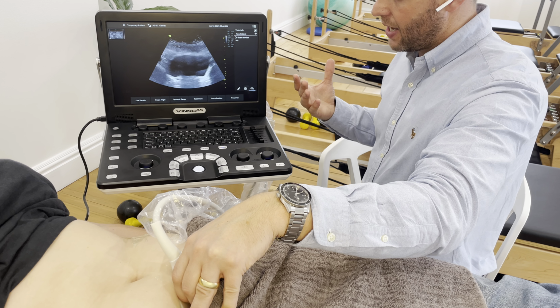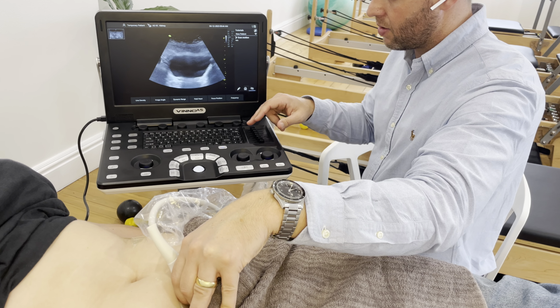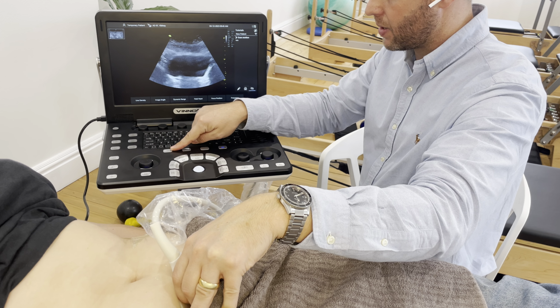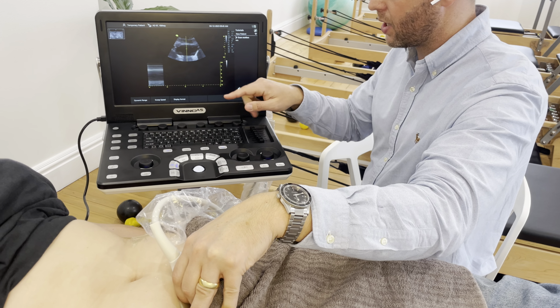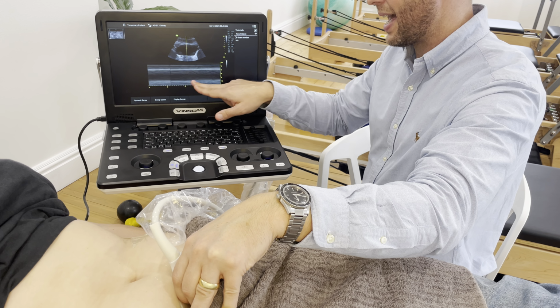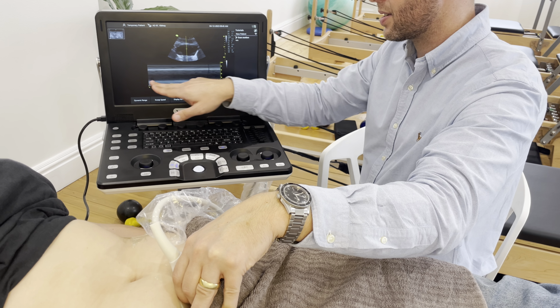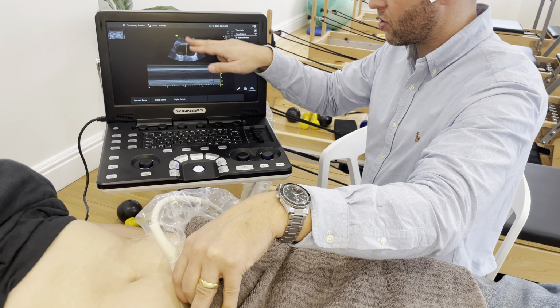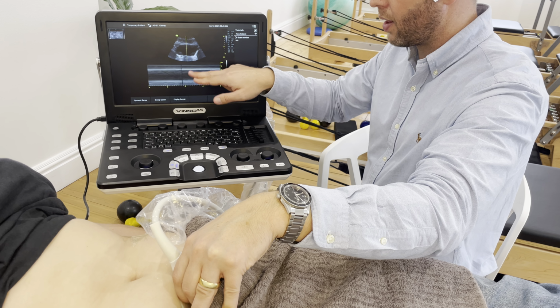If we want to actually measure how big that is, there is a way that we can do that in real time, and that's using M mode. So M mode is up here. So we press M mode, and what it does is it gives us the picture at the top, so this is our B mode image, and it gives us the M mode at the bottom. So that's movement over time.